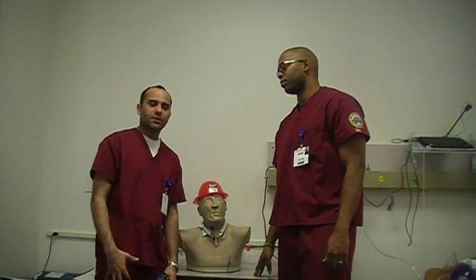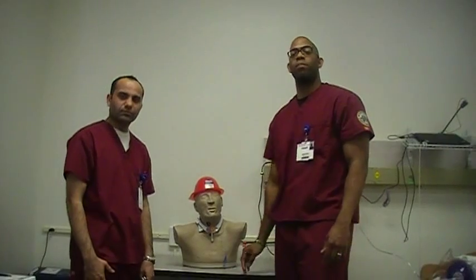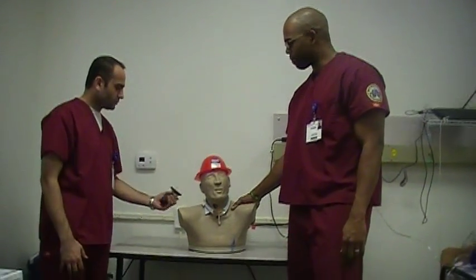My name is Joe. My name is Yatine. We're here to demonstrate airway cuff pressure management. This is our colleague, Mr. Fire Marshal Bill.